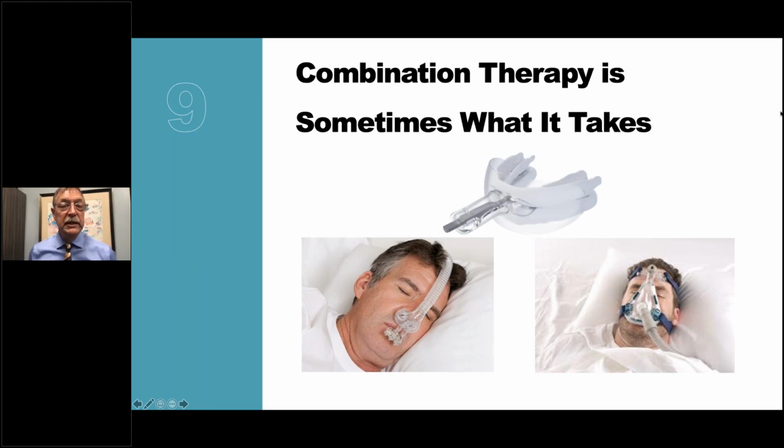It covers the stick that's out front, which is the adjuster section of the MyTap if you're unfamiliar. And it goes under the lips. It's really hard to take a picture of a clear silicone thing on a white background, guys. Sorry about that. And so what you can pick up from this picture is that there's a silicone flange that goes in front of the MyTap.